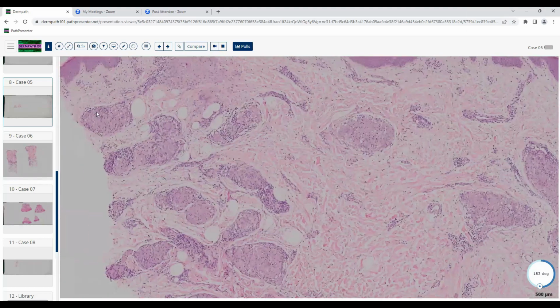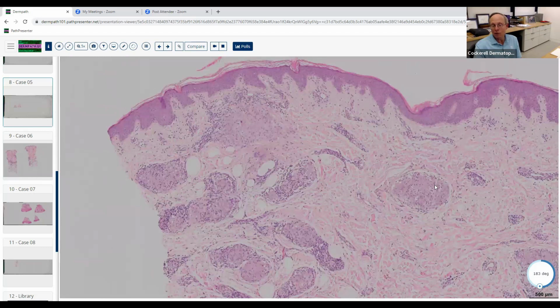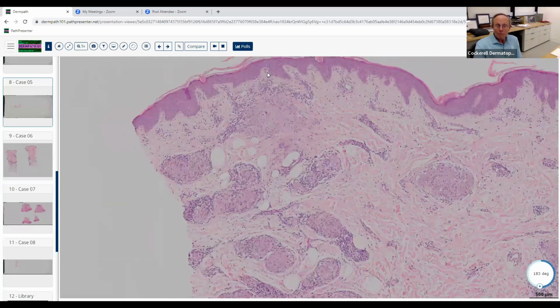Yes. Okay, so we just got through having Lichen Nitidus. It's a beautiful, nice contrast between that. So let's say they took a shave biopsy like the Lichen Nitidus case, and they happen to hit this granuloma. You would not call this Lichen Nitidus because notice it doesn't have the ball and claw-like morphology here. It's involved in the papillary dermis a little bit. It's mostly in the reticular dermis, but notice that it's got a small nodular aggregation of mostly histiocytes with some lymphocytes here. And it's not involving that little ball and claw.